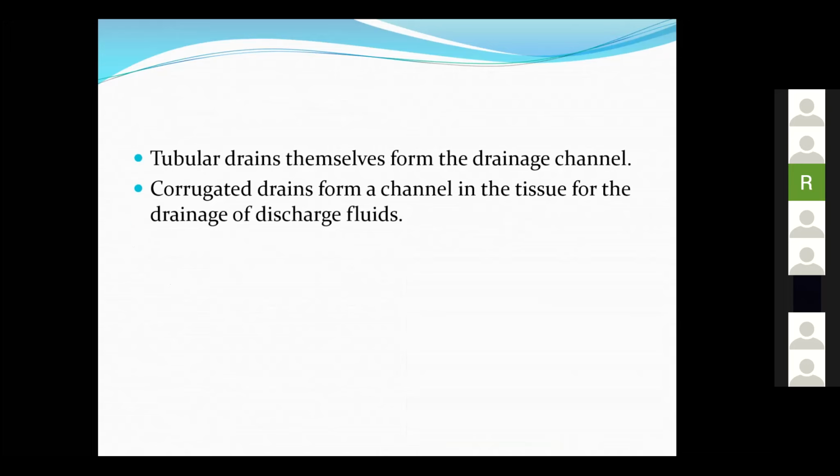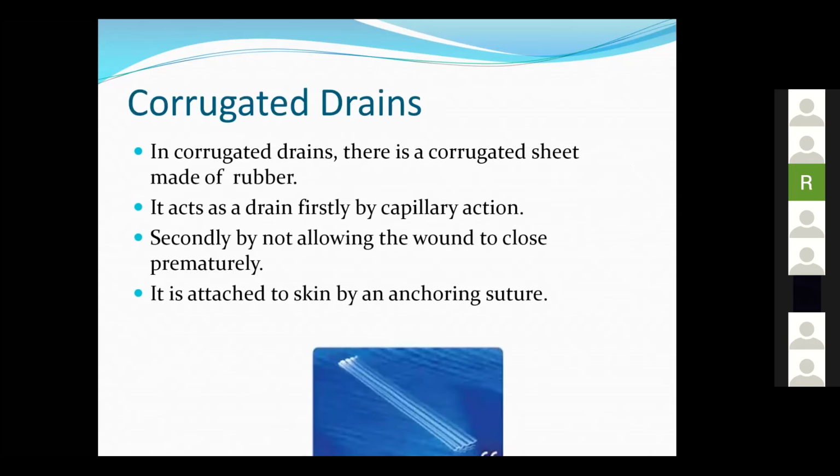We can alternatively use a tube drain like a nasogastric tube, but it has a few holes. It has a complete ridge, so it is easy to take things out. Sometimes when corrugated drains are not available, we take a nasogastric tube, make a slit in it long enough, and take a piece out, so then it becomes a tunnel where the fluid can be drained out easily.